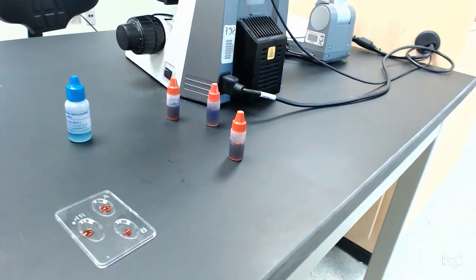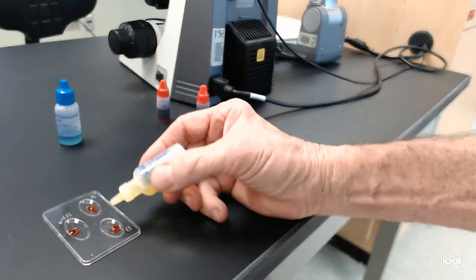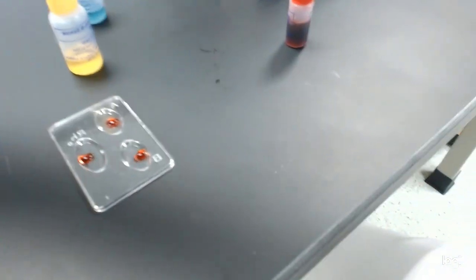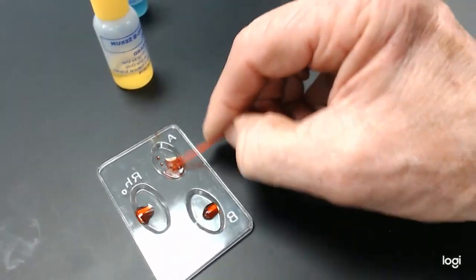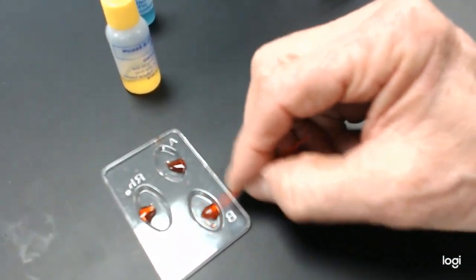I have the B. Whoops, almost put it in the RH. That would have been a mini disaster. Okay, so now I've got my three samples, and I stir them up, and I see if any of them start clotting up.